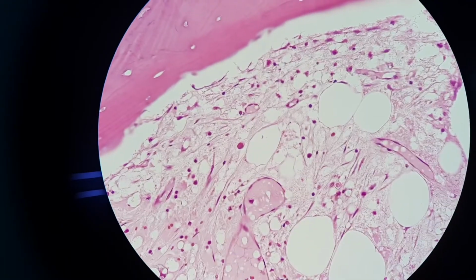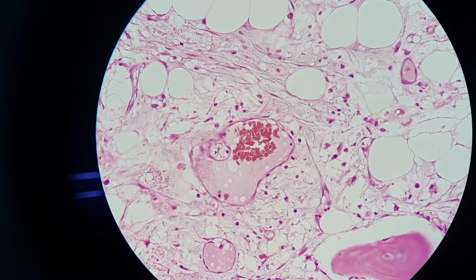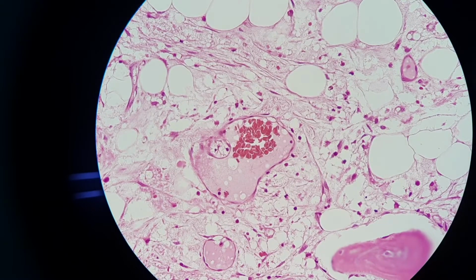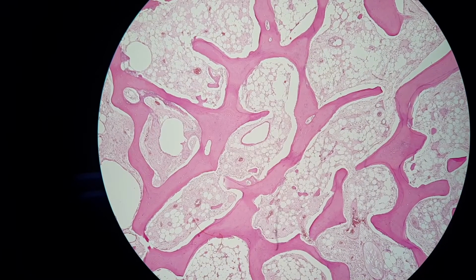So in this area is actually where the marrow spaces are, and currently they have been replaced with fatty tissue. You can see the vacuolated areas there are actually the fatty tissue, and at the center here is currently one large capillary. The center contains a lot of red blood cells, forming sort of vague rouleaux formations with adjacent fibrin at the side there. Okay, so we're back to low magnification, so it is easier for us to screen through these slides.